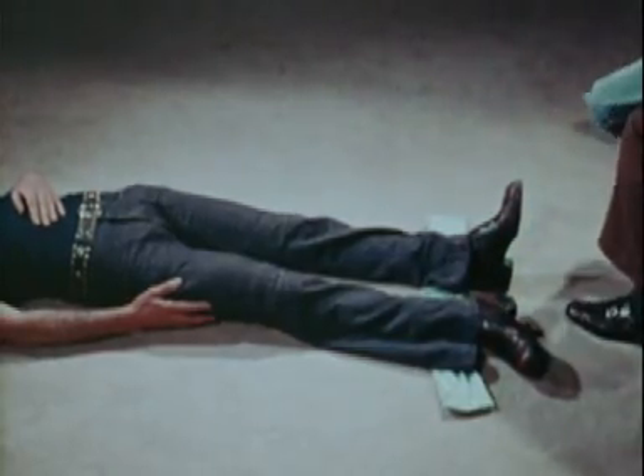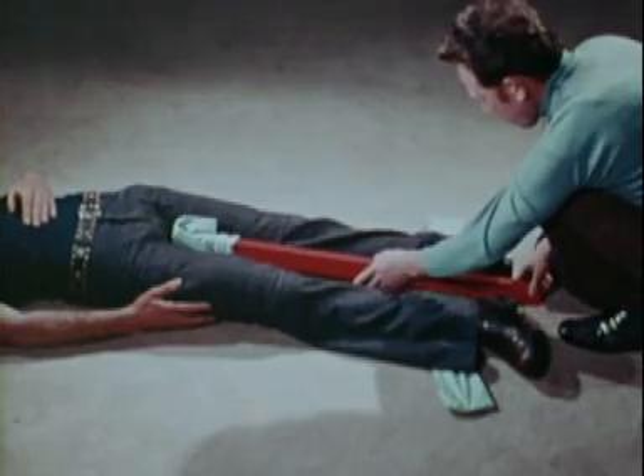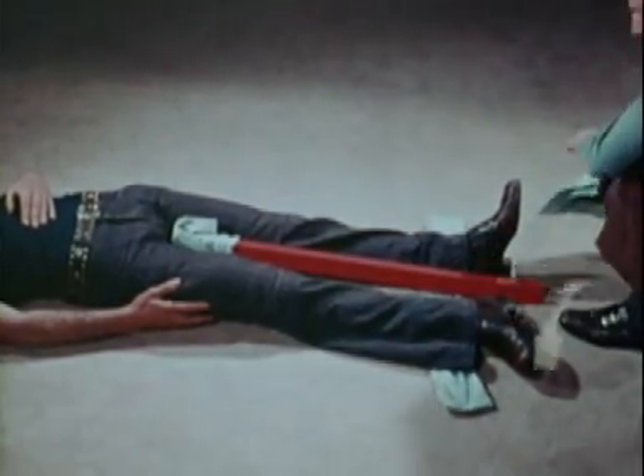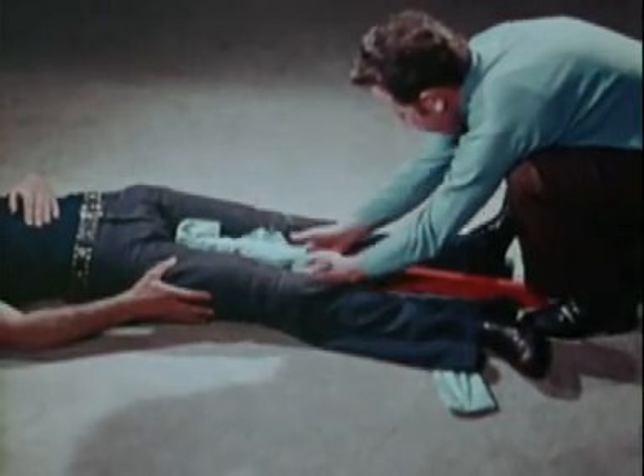Place a splint between the legs extending from the foot to the crotch, padding it well at that point. Pad carefully at the level of the knees and ankles.